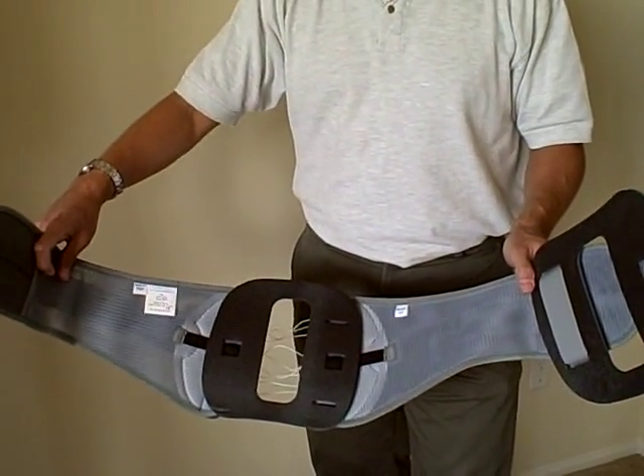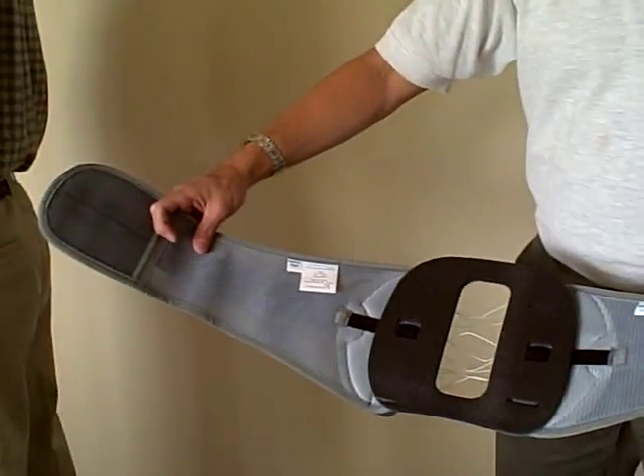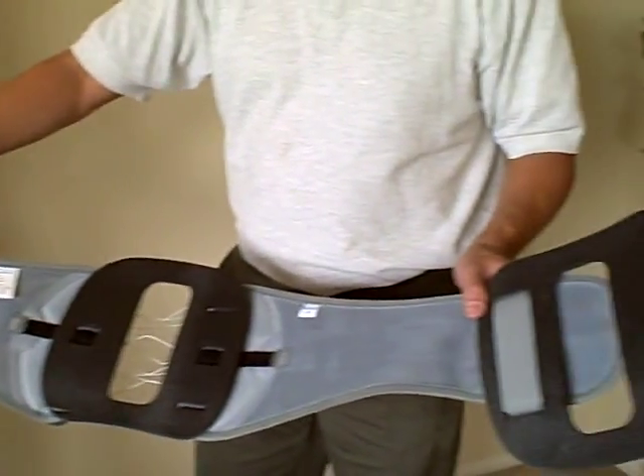This is the Flex Power Plus Back Brace by CyberTech. It consists of a gray brace with a front and a back panel.